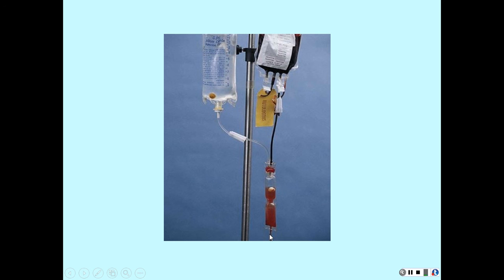I'm sorry, you were talking about the blood, not the saline per se. But if you don't think you have enough here and you may get air down in here, you can squeeze that and pull your blood on down, just like you did with your saline.